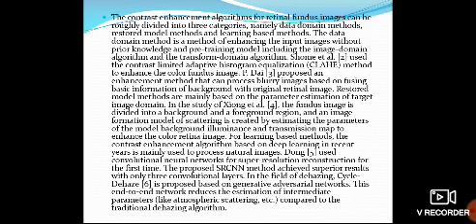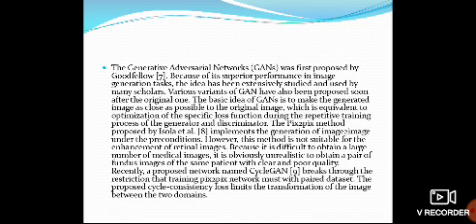This end-to-end network reduces the estimation of intermediate parameters. The GAN, also called generative adversarial networks, was proposed by Goodfellow because of its superior performance in image generation tasks. The idea has been extensively studied and used by many scholars.